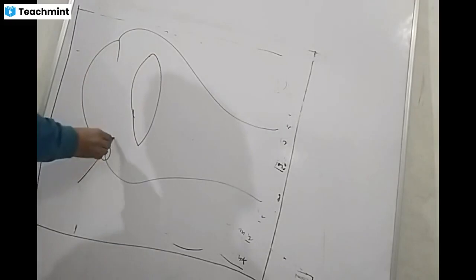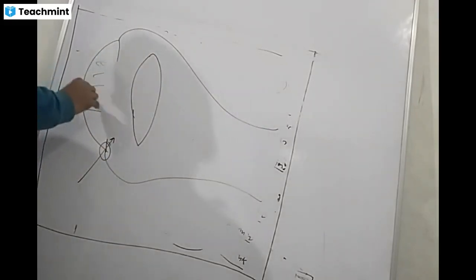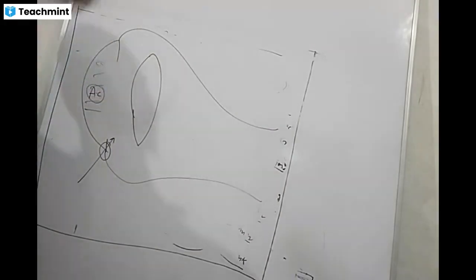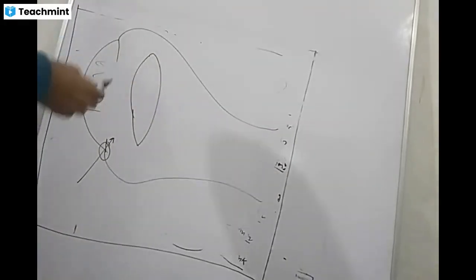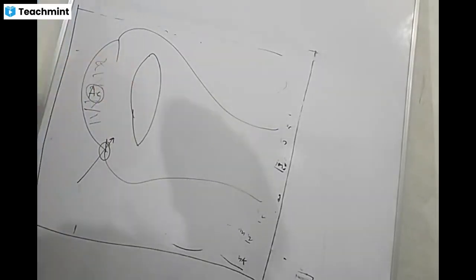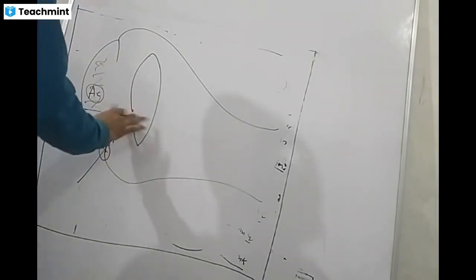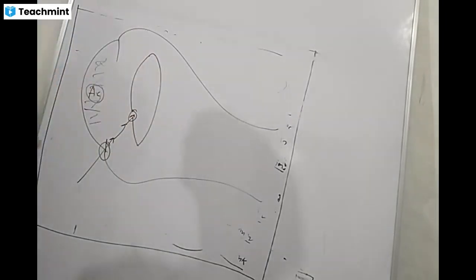First we made an incision and entered, then we put some viscoelastic substance into the anterior chamber, like hyaluronic acid or carboxymethyl cellulose. They are viscous and will not allow it to collapse. After this, we enter more. We make one nick here, capsulorhexis; the anterior capsule is there.